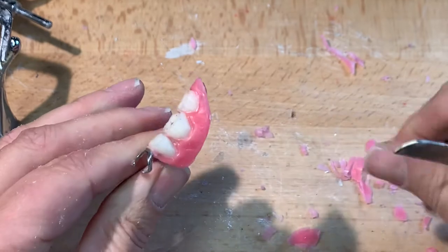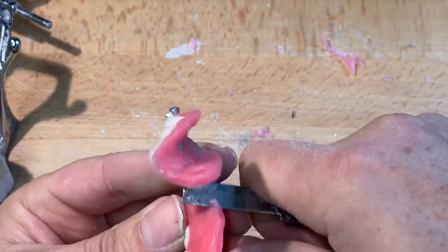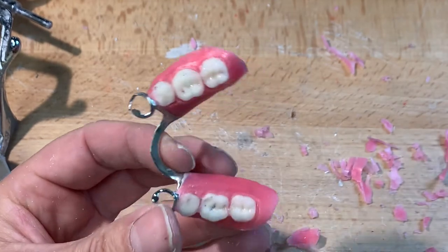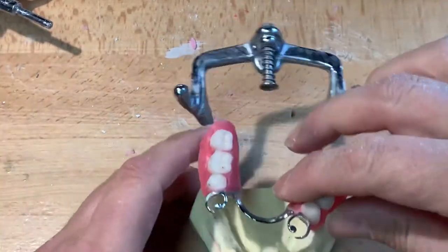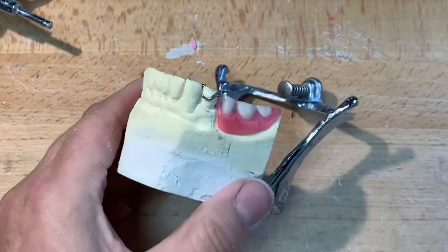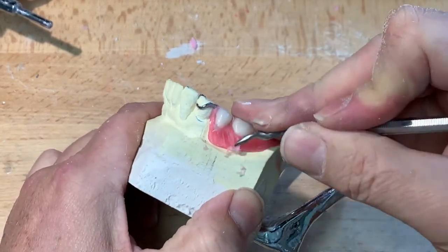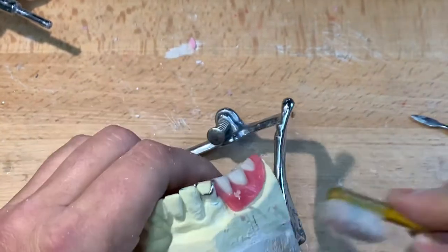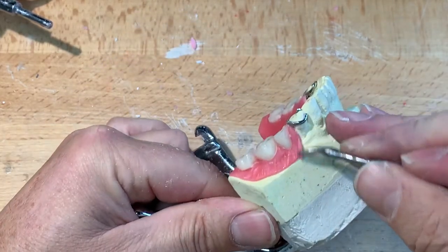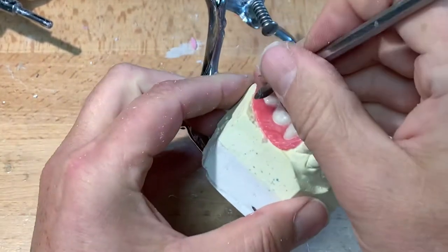We'll be able to say: yes, that is the extension, that is the contour, that is the shade, and that is the bite. Now naturally there will be some adjustments post-insertion. Let me just touch this up a bit — it's a little bit thick. I don't want this to bulk out more than we have to. If it was a wax-up for finish, I may leave it slightly bulkier so I can always contour it with a burr, leaving room for polishing.